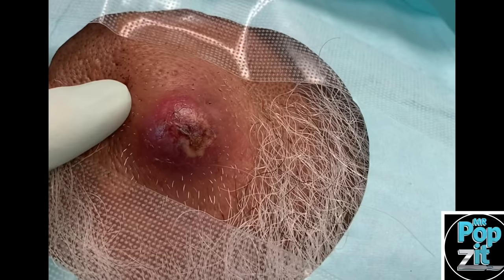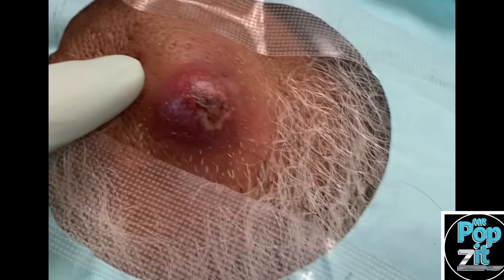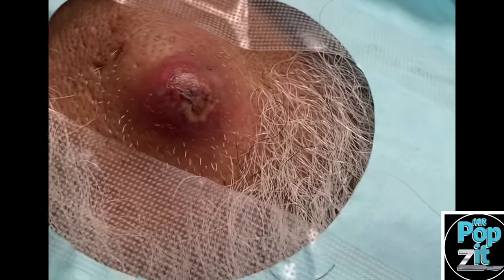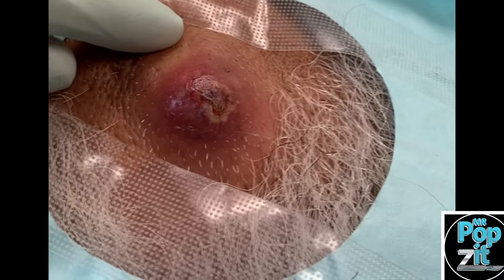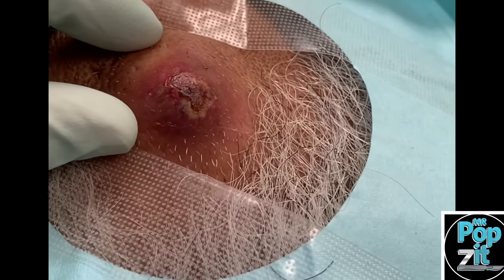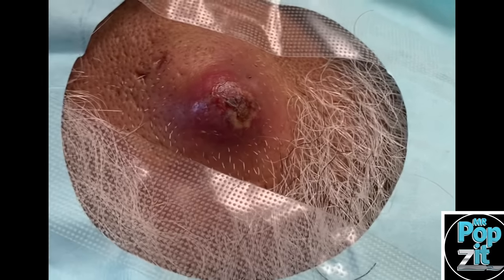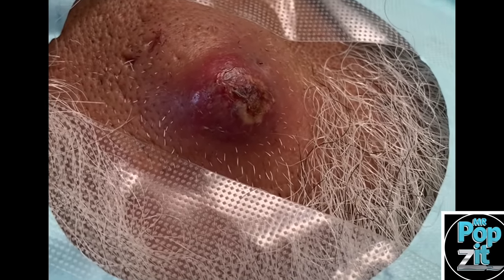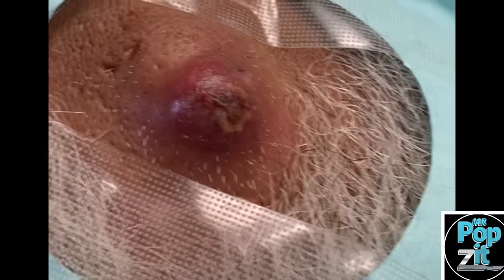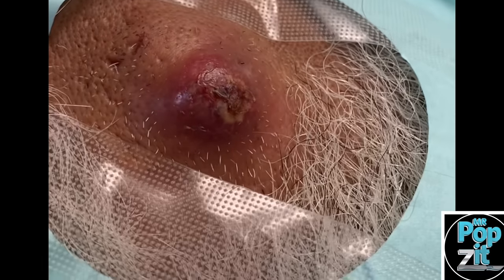It does work a little bit, so it's going to take some of that bite away. Then we're going to do just a little incision and drainage, culture it, and get them on a good antibiotic. This will dry up nicely. If there is a cyst in there — which I believe there is — we're going to have them back to do a little excision to remove it so this doesn't keep happening.